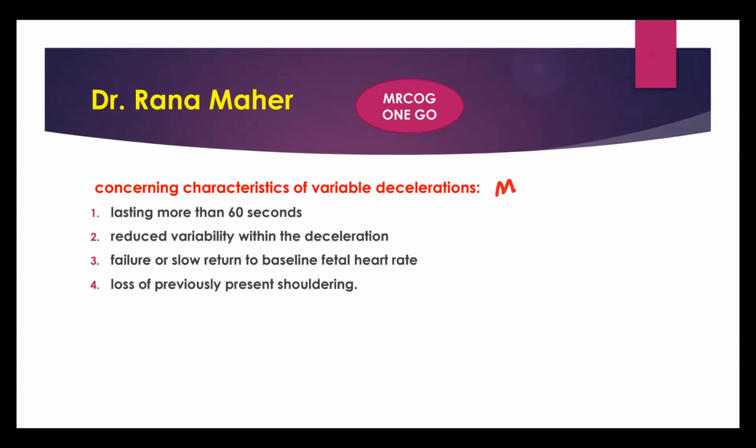So we have the deceleration, and then we will have the shoulder, and then going down, and we have the variability here in the deceleration, and then the shoulder, and then coming back to the baseline. Sorry, guys. Coming back to normal. So this deceleration lasts for 15 seconds.